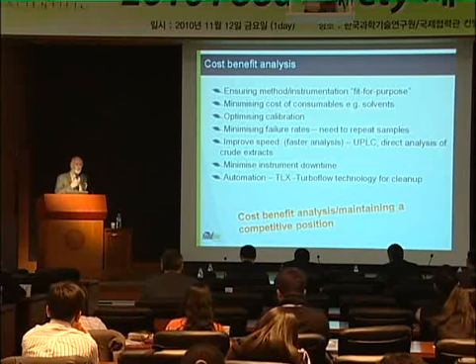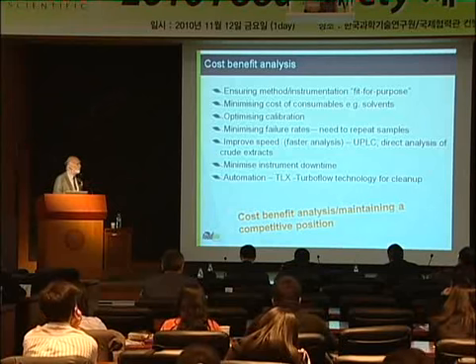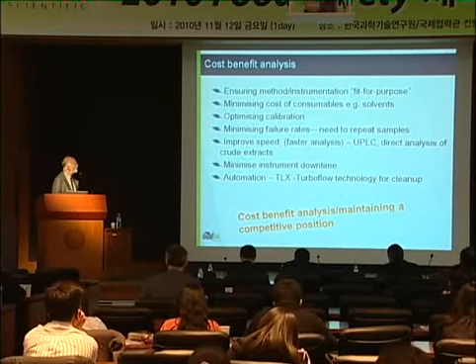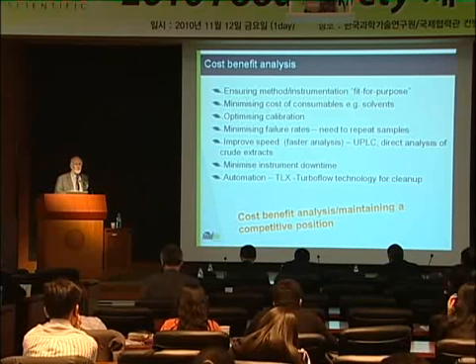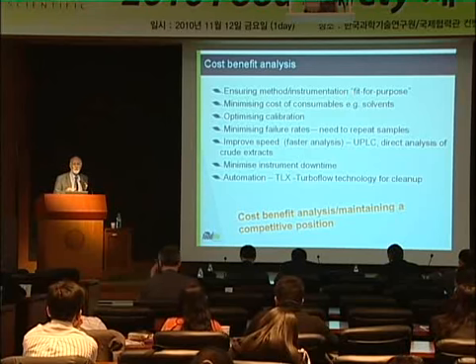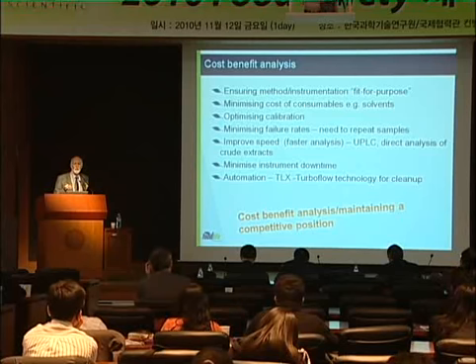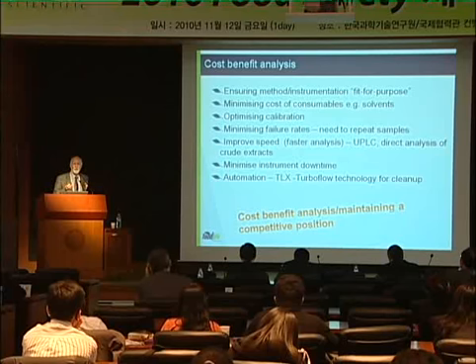If price is an issue, and it is an issue in food testing, you need to keep an eye on a number of things in the laboratory. One of them is to make sure that instrumentation and methods are fit for purpose. It's very tempting to move all of your methods to very sophisticated instruments, to use LC-MS to do everything. But of course it's a very expensive instrumentation. There's a lot of pressure on the availability of the equipment. So making sure that you use the most appropriate instrument for the most appropriate measurement is important.